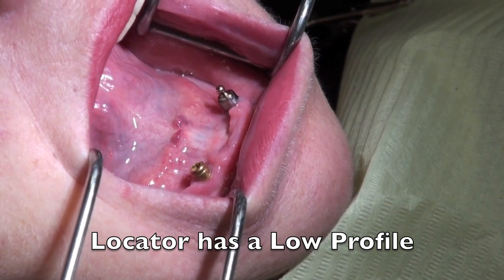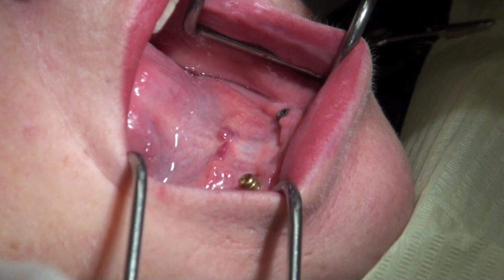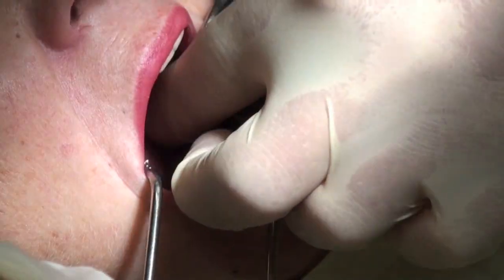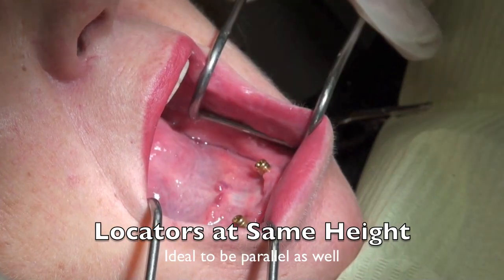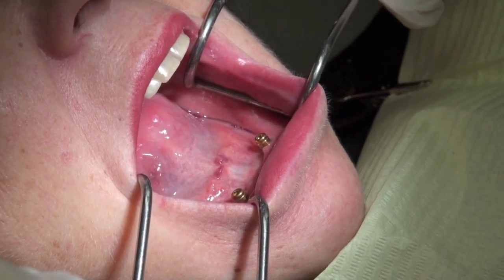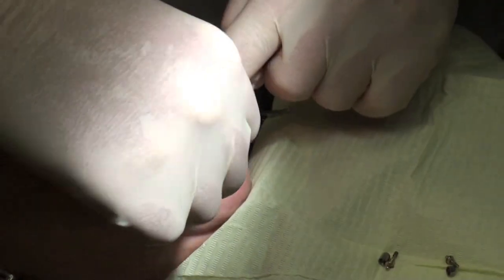Here you can see the height difference between the locator and the ball — it's actually quite something. We're going to remove the other attachment and start to put a locator on that spot as well. The abutment for that implant is a little bit shorter because this implant is a tiny bit higher, and we want these two locators to be at the same height. It's ideal they're at the same height, so you get the same kind of pivot point on the locator itself. We tighten this down to about 25 newton-centimeters.